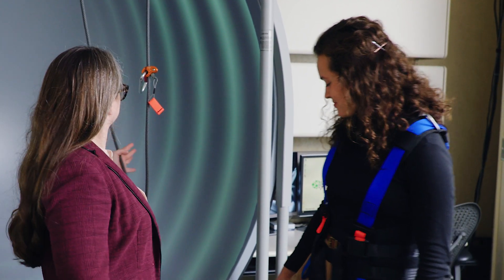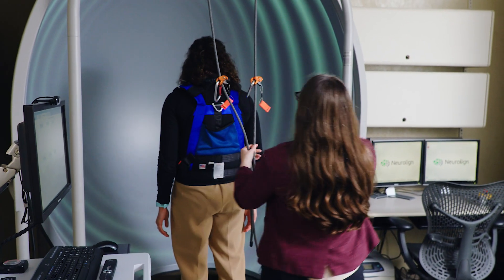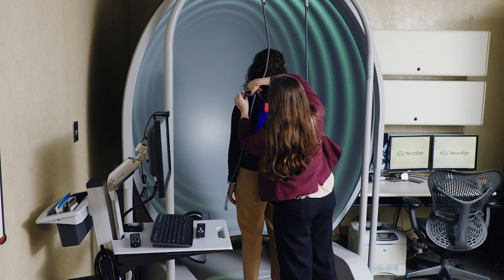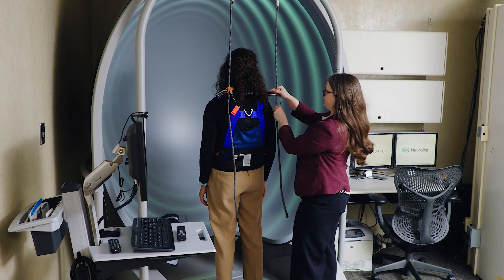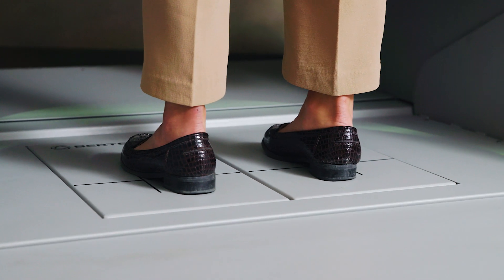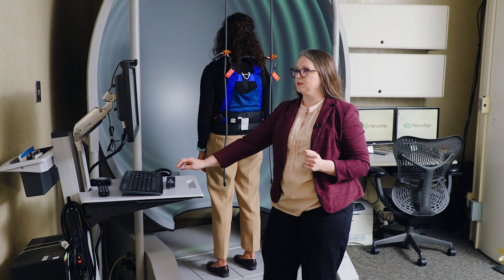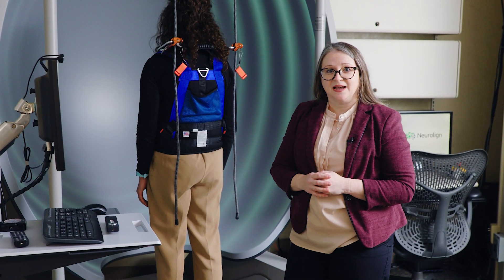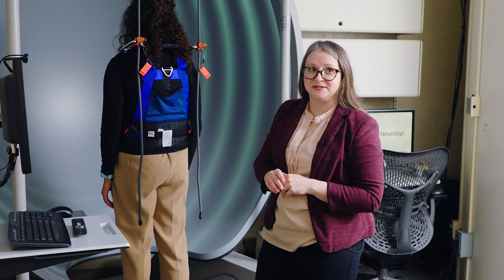Sarah will be facing away towards the tunnel and attached to the equipment so that she's secure. Her feet are lined up on our force plates, and then we're able to measure how much her balance changes over different conditions. The first condition is very simple — we're just measuring how well she does standing with her eyes open without any additional cues. The second component is to evaluate how well she can stand with her eyes closed. That's again a very simple measure, but one that can be a little bit harder.